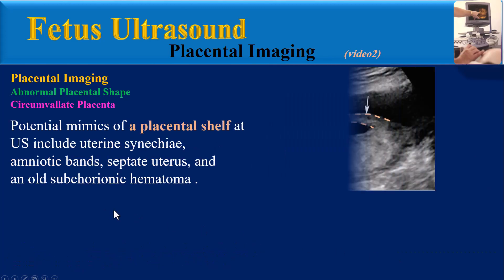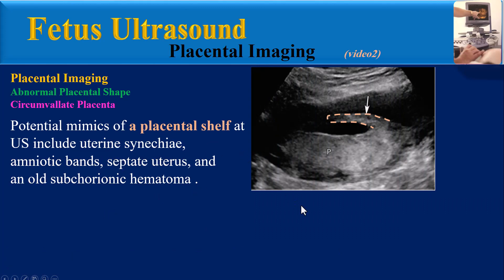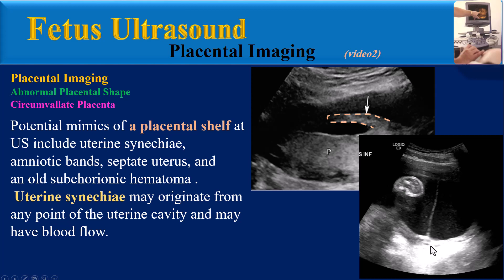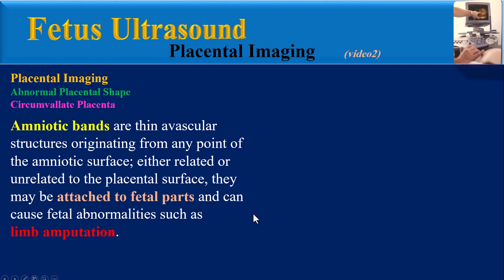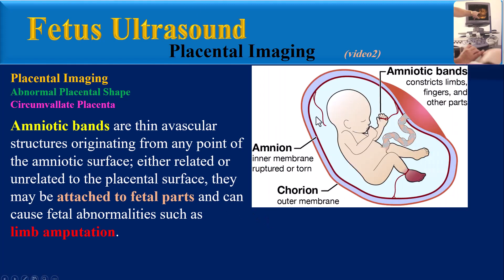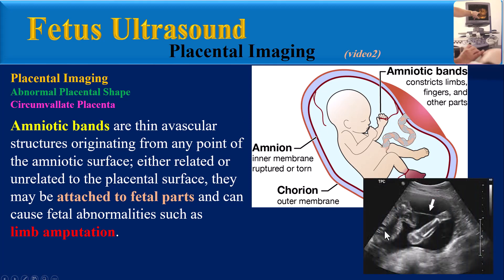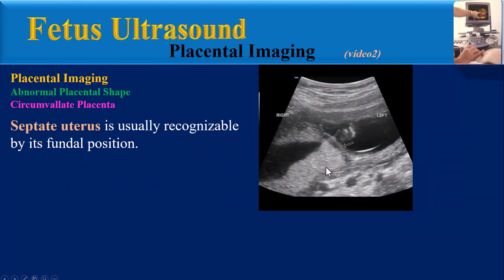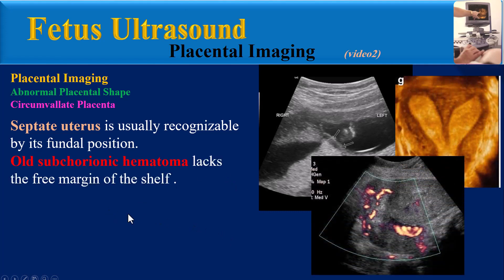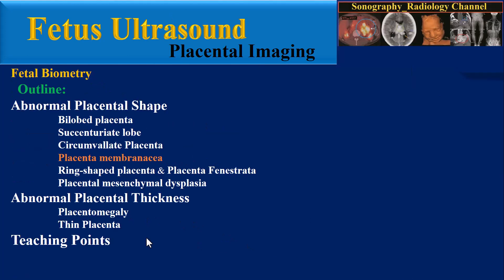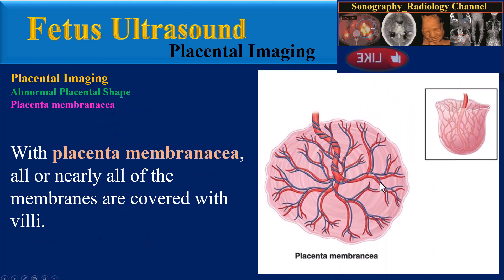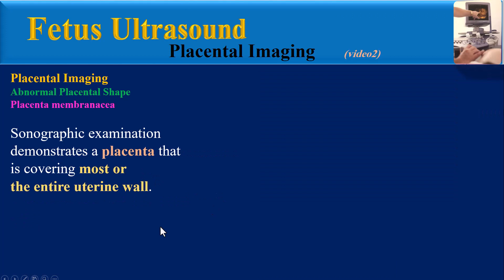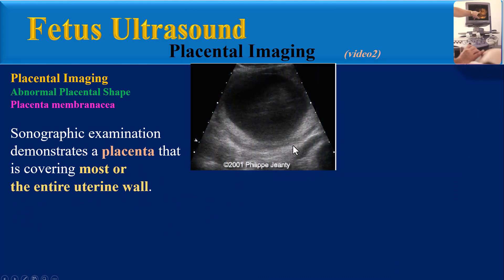Potential mimics of a placental shelf at ultrasound include uterine synechia, amniotic bands, septate uterus, and old subchorionic hematoma. Uterine synechia may originate from any point of the uterine cavity and may have blood flow. Amniotic bands are thin avascular structures originating from any point of the amniotic surface, either related or unrelated to the placental surface; they may be attached to fetal parts and can cause fetal abnormalities such as limb amputation. Septate uterus is usually recognizable by its fundal position. Old subchorionic hematoma lacks the free margin of the shelf.